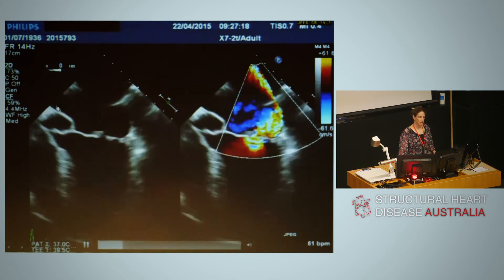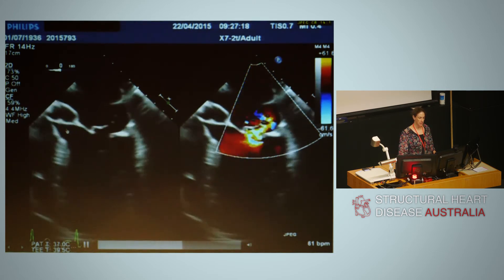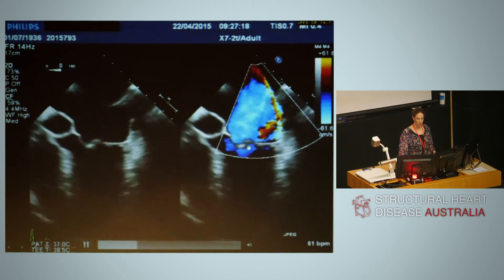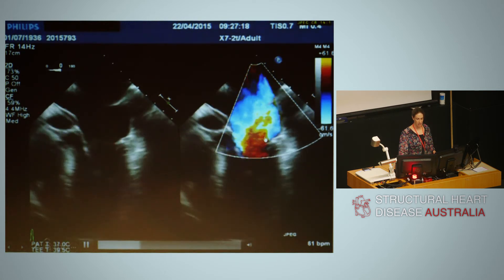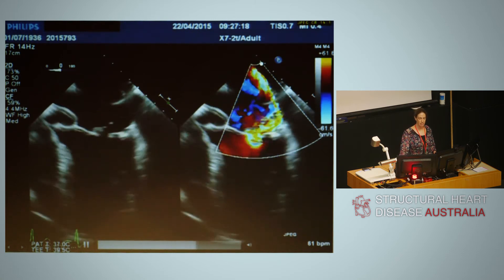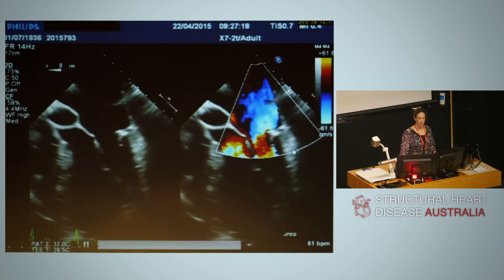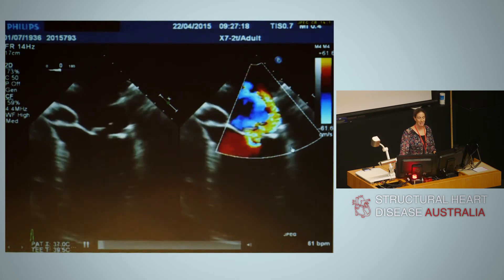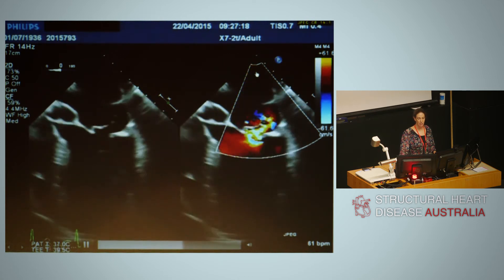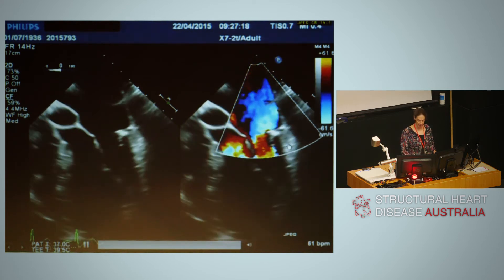This is a transesophageal image — a four-chamber view with aorta, anterior mitral leaflet A1-2, and posterior. We can see there's a flail segment and flail cord at A2. The jet is eccentrically directed and impinging on the lateral aspect of the left atrial wall. These impinging jets look less severe than they are because the jet cannot entrain the blood on the constrained side, appearing about 40% less than a central jet.